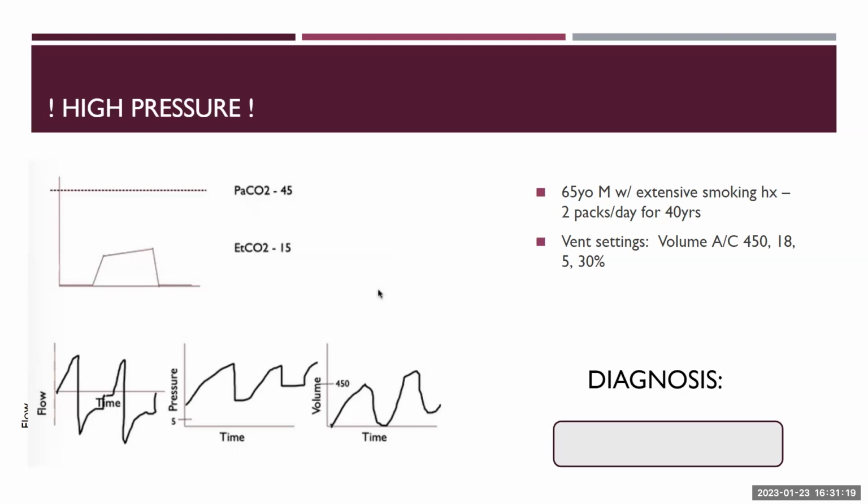Okay, so it seems like the end tidal CO2 is low in this patient, so there's a big gap. And then the flow, I can't tell, but maybe they're inspiring before expiration is over.